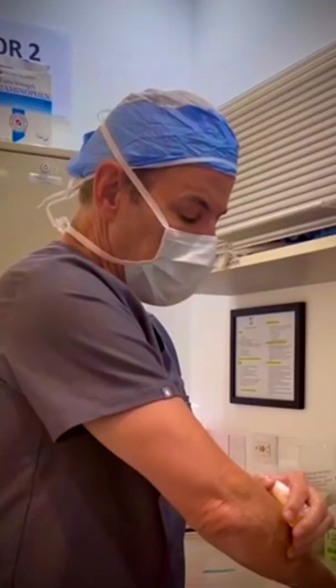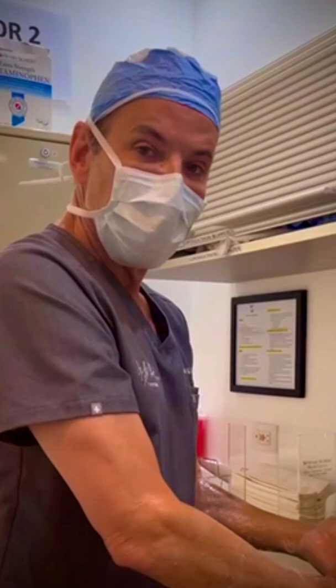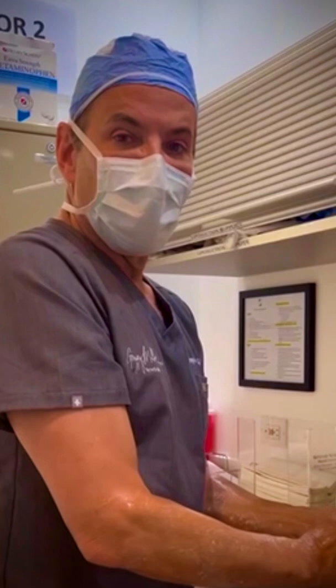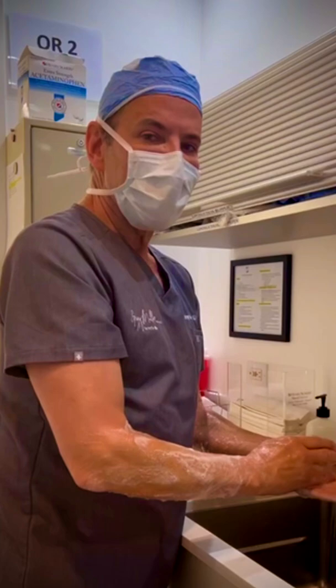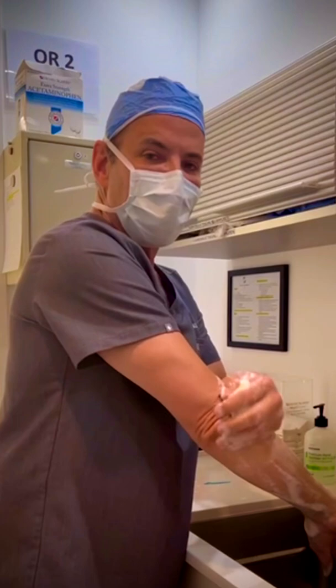So we're going to head to the OR. Today's procedure is MyElevate. We're going to start with a division of the platysma band, then inject some numbing medicine, then do something called tunneling, and then treat her with the Precision TX laser — an amazing laser that tightens and tones the skin. After that, we're going to remove a little bit of fat, and then the final ribbon on the package will be placing the MyElevate sutures. Stay tuned — we'll show you all the different steps.